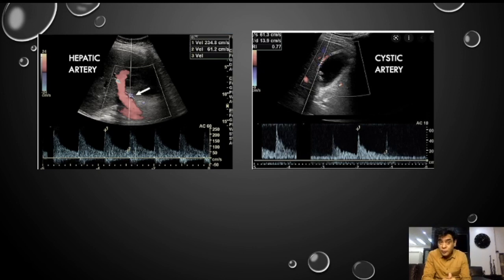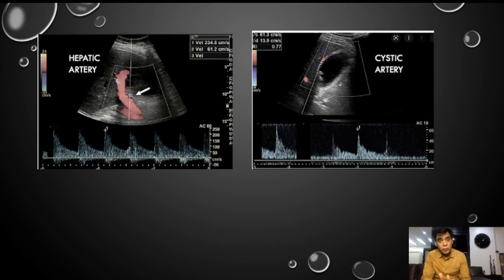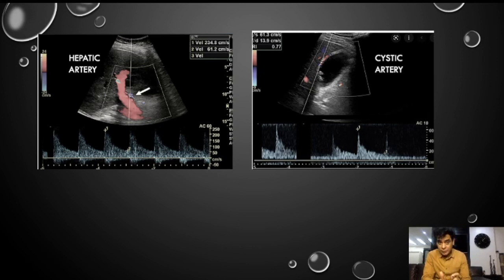Now what are the problems with hepatic artery Doppler? The problem is that when we take hepatic Doppler values as positive and use them for differentiation from chronic cholecystitis, that is fine. But we have to remember that they are not specific for acute cholecystitis — this increased velocity can also be present in cases of hepatitis. So here, cystic artery Doppler becomes more important, because if you want to be specific, cystic artery Doppler is more helpful.